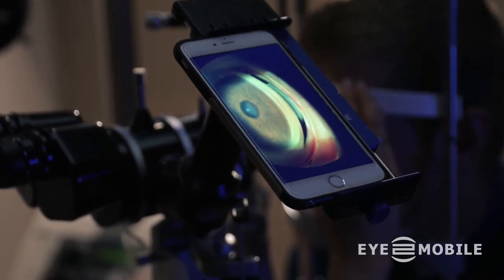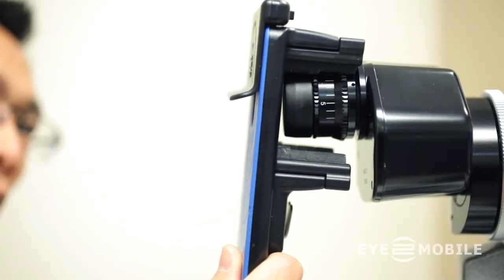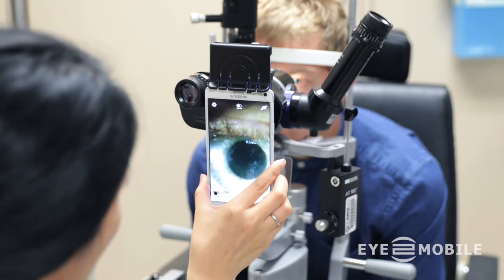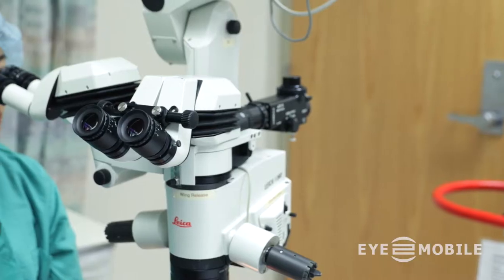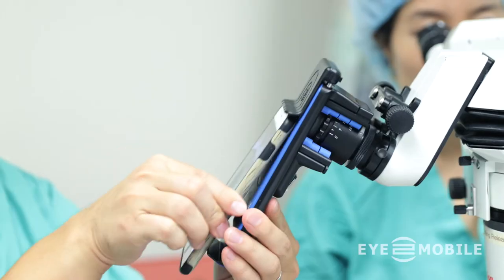iTWO Mobile's PhoneDock is so easy to use. Clamp the optic jaw onto the eyepiece and dock the phone right into view.